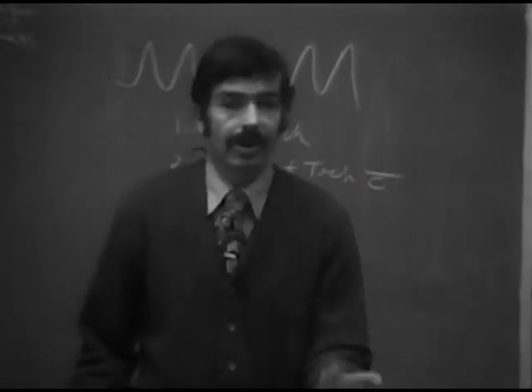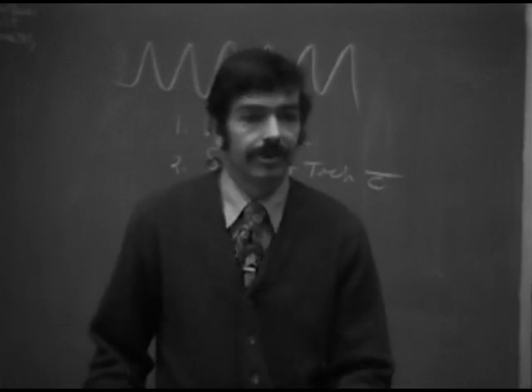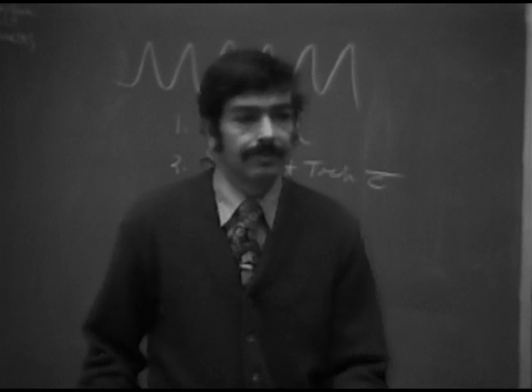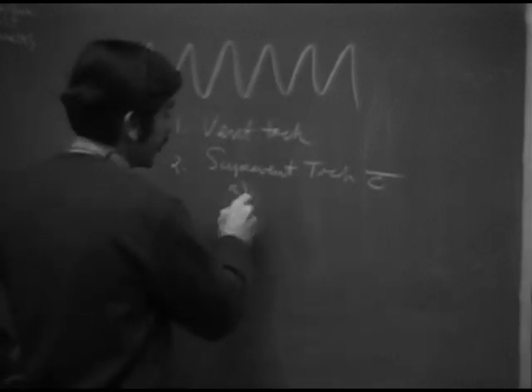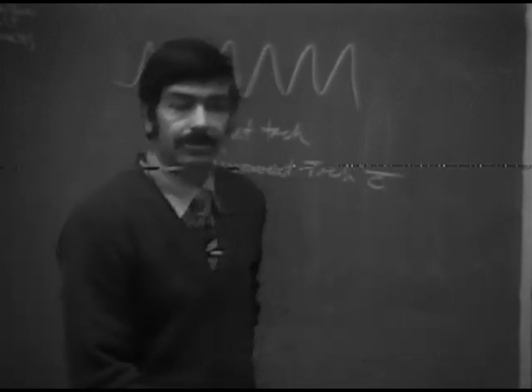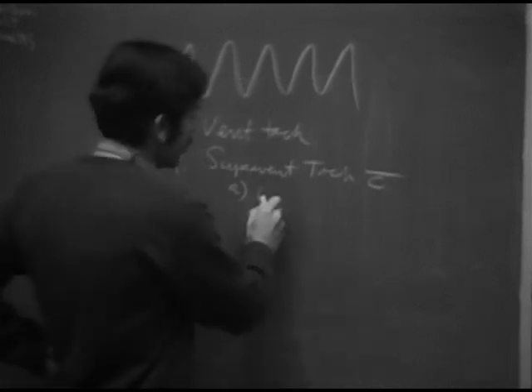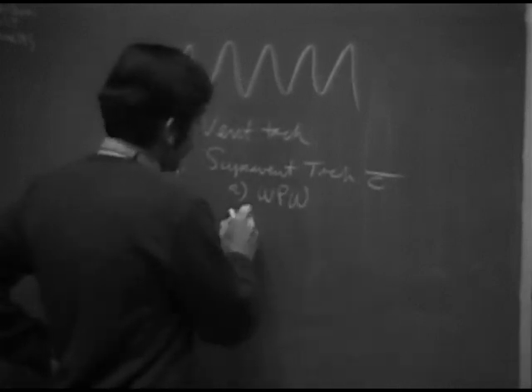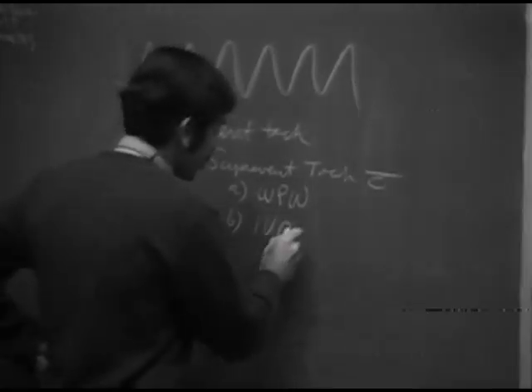Now, what will give you a wide QRS complex and have a supraventricular rhythm? Bundle branch block certainly will do it. Well, we'll just go down our routine. If the initial part of the QRS is prolonged, we think of Wolff-Parkinson-White. If the whole QRS is prolonged, we think of intraventricular block.